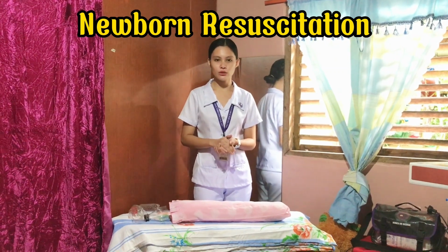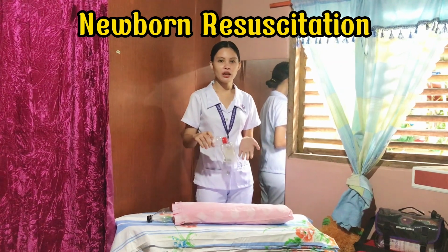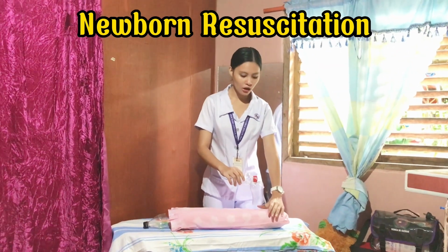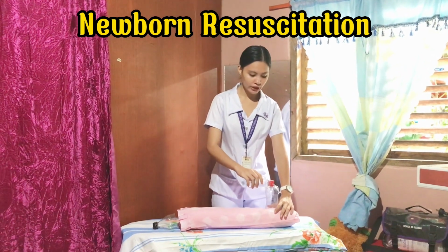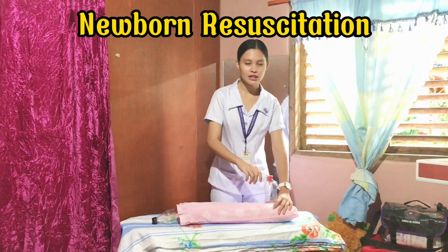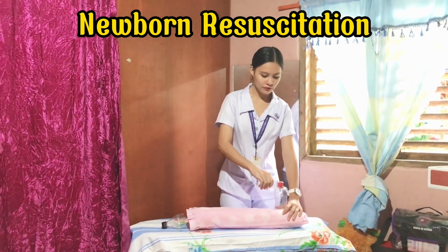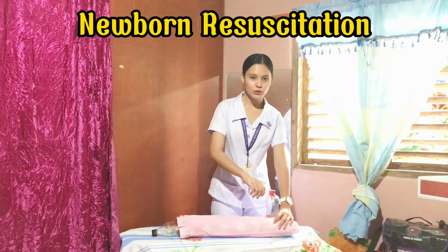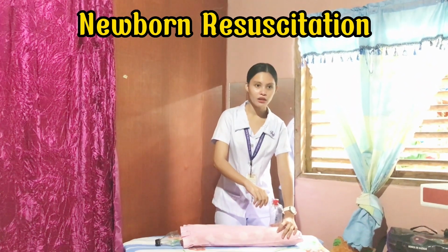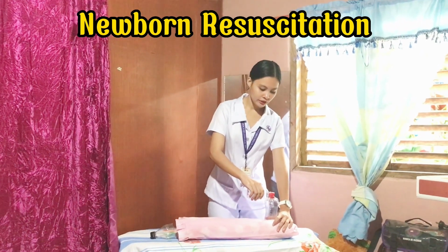So I'm going to attach the bag mask and cover the nose and the mouth of the baby, the newborn. So we're going to do 30 seconds of ventilations. So in order to do this, we're going to watch the rise and fall of the chest of the newborn.